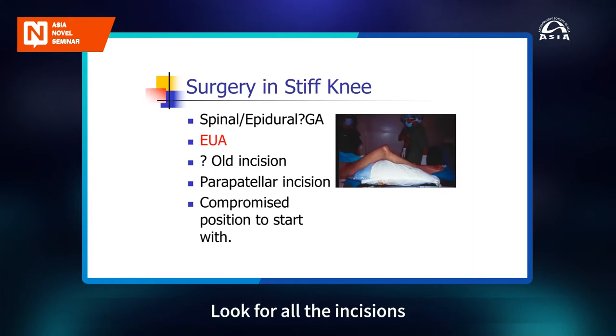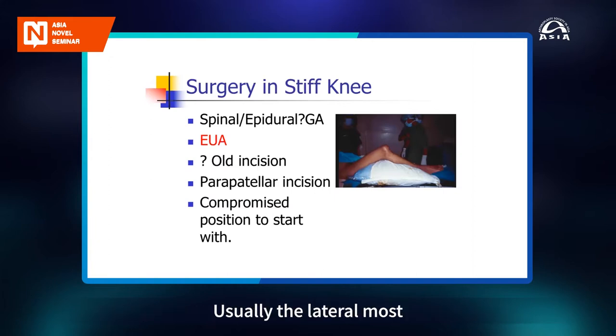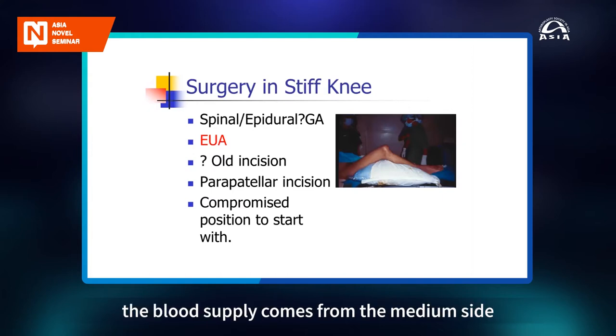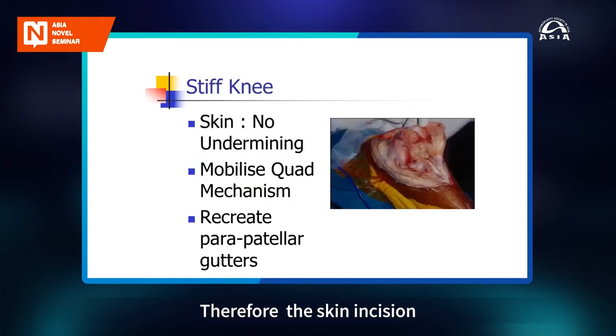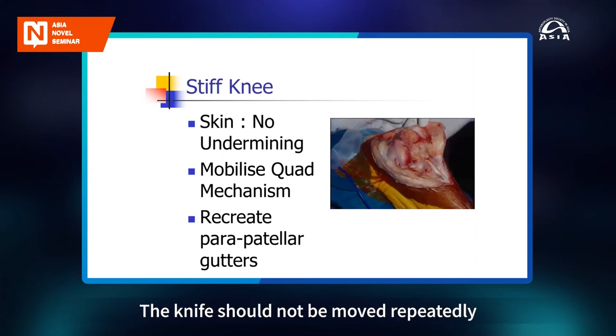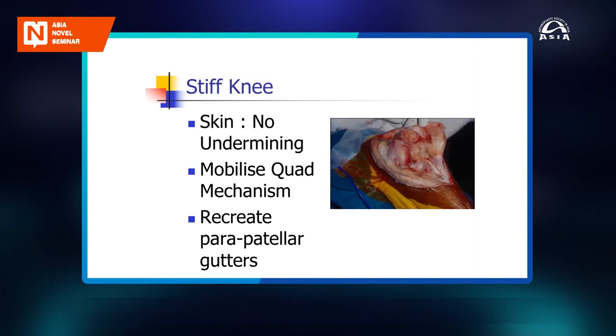Look at all the incisions and decide which incision you will use, usually the lateralmost, keeping in mind the blood supply comes from the medial side. Inside, when you go, you use a parapatellar incision, and this is a compromised situation. Therefore, for the skin incision, there should be no undermining. The knife should not be moved repeatedly. It should preferably be one simple clean cut down to bone.